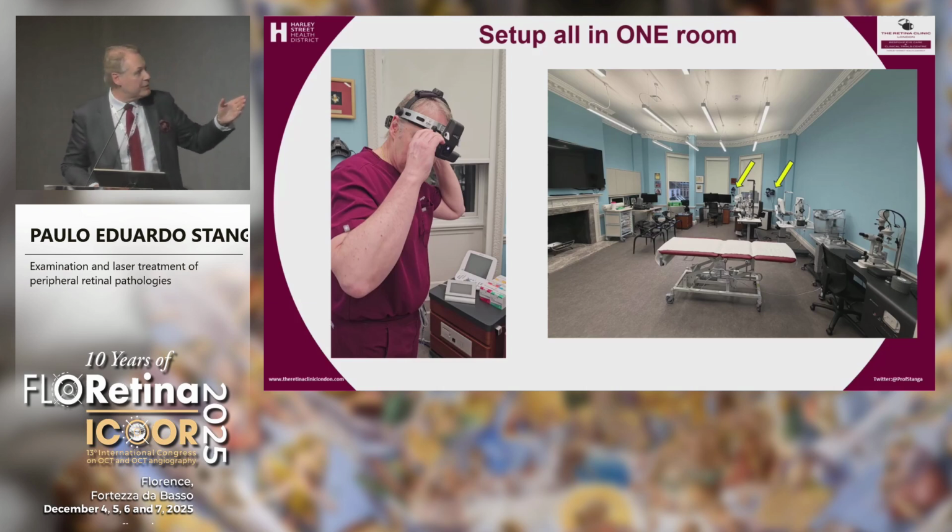That's my office. I have a couch because almost every patient, if not every patient that comes to see me, undergoes indirect ophthalmoscopy with indentation. You can see here the indirect ophthalmoscope. So I stretch my arm when I'm sitting at the desk. I grab the indirect, and I do indirect ophthalmoscopy. And this is the indirect laser, which I'm going to discuss later.